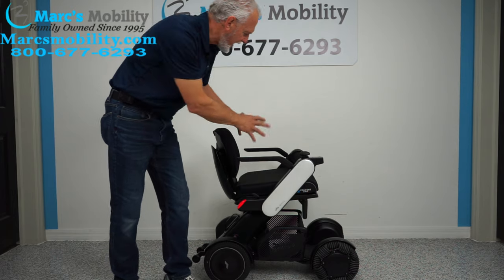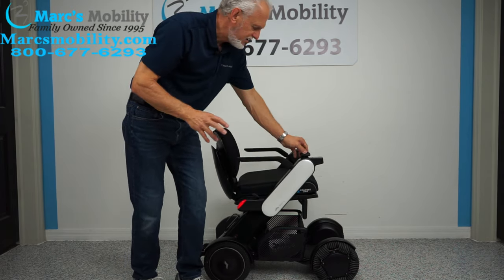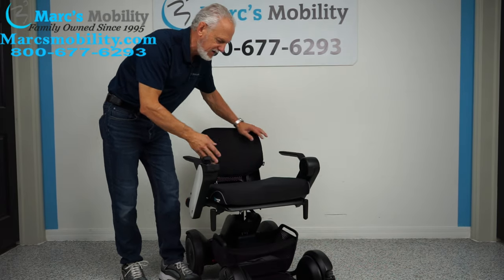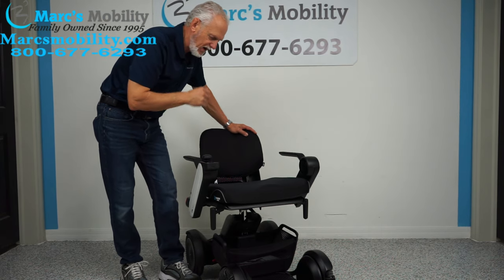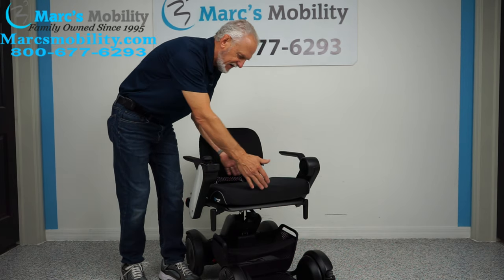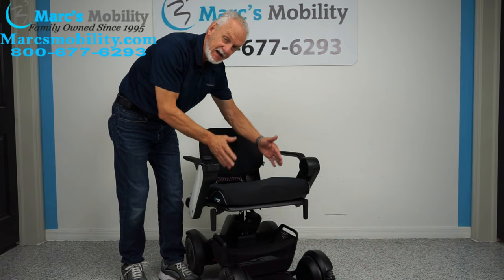It has a maximum weight capacity of 300 pounds. This chair has the 20 inch seat, but it comes in three sizes: 16, 18, and 20 inches wide. It also comes in 16 or 18 inch depth, so you have two choices of depth — 16 or 18 — and three choices of width: 16, 18, or 20.